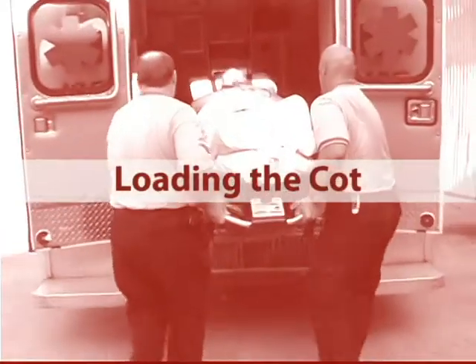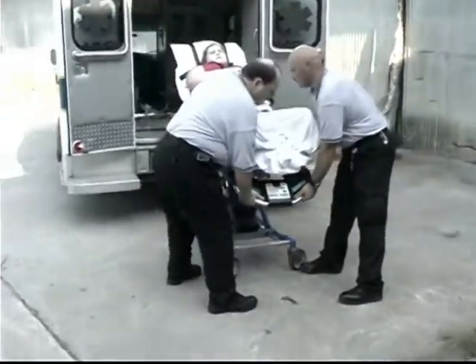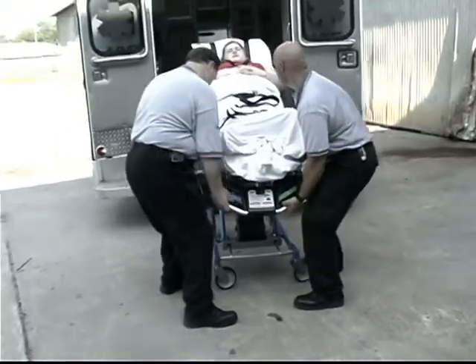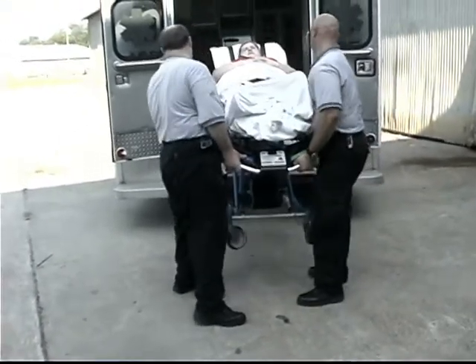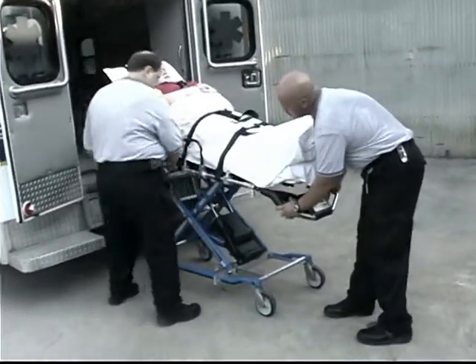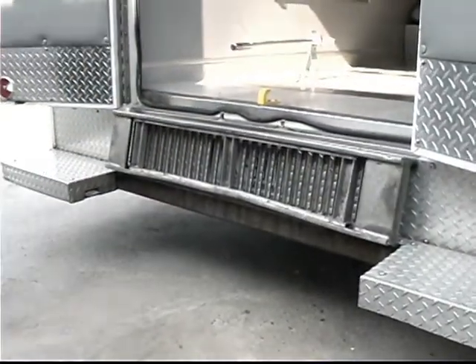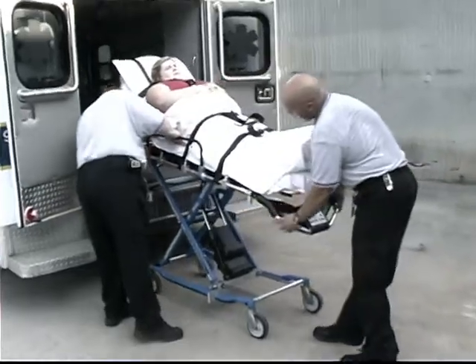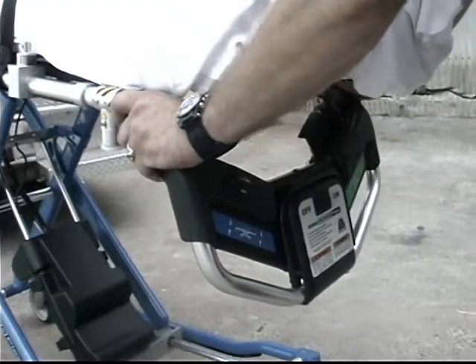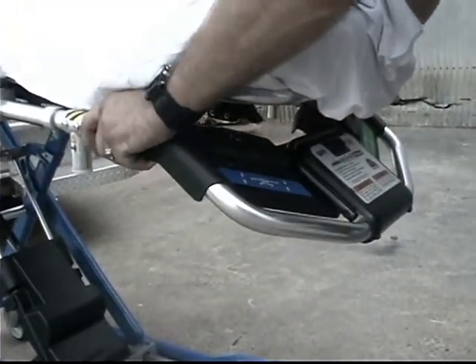Loading the cot. Loading a cot with a patient on it requires a minimum of two trained operators working together. Both operators may stand together at the foot end corners of the cot while loading it. The cot can be loaded into ambulances with floor heights up to 34 inches. To load the cot, raise the ambulance folding bumper if present. Raise the cot to its loading attitude and raise the drop frame to the extended position. Adjust the foot end lift bar as desired. Verify the lift bar is locked before elevating the cot.